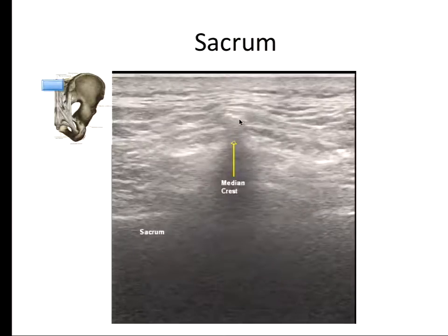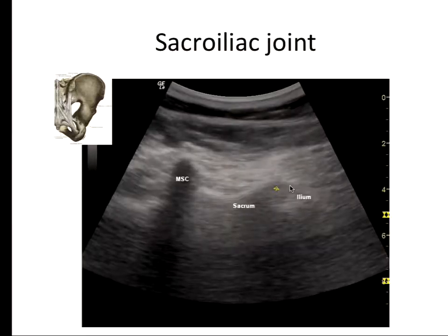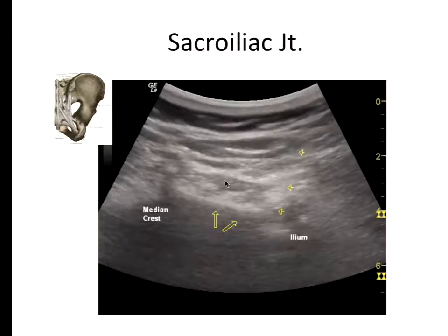If you want to start scanning from the lumbar spine, that's also fine — you'll notice the difference in architecture as you move further down. In a transverse view you have the sacrum and the ilium. As we move further, when you bring the sacroiliac joint to the center of the screen, this is not how it would normally appear in patients we typically inject because a lot of it is fused. So you want to identify the S1 foramina, then the S2 foramina. The chances of success are much greater when you approach at S2. If you can visualize that small gap, that's where you want to target.